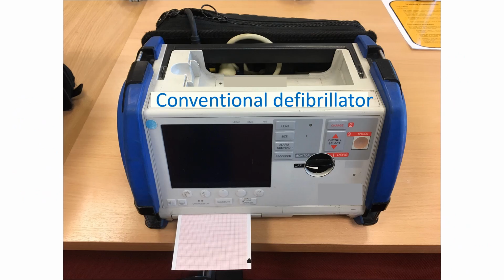What precautions are to be taken while using a defibrillator? A conventional defibrillator is not for use by a layperson. It is to be used only by trained medical personnel. But AEDs can be used by laypersons with minimal training as it has automatic analysis and gives audio prompts.